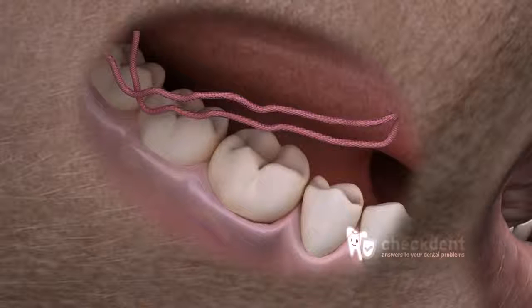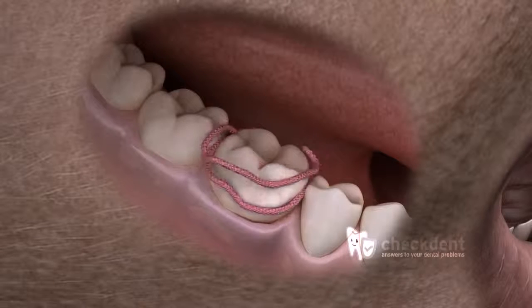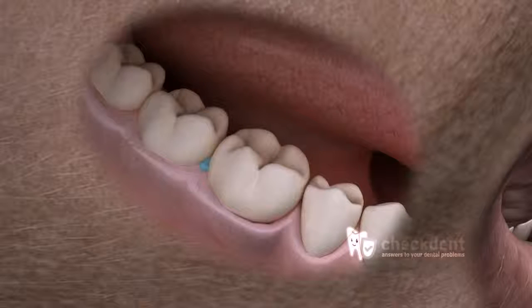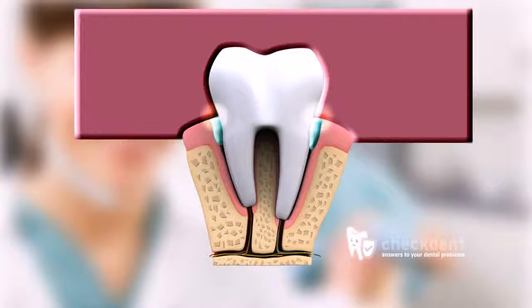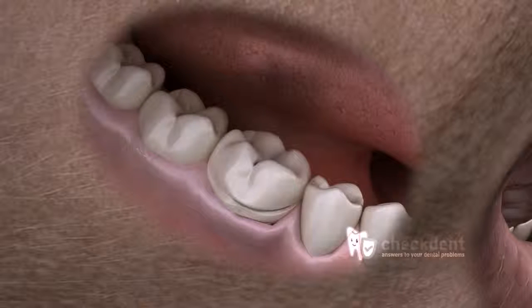Furthermore, particular criteria must be observed while taking the impression. For example, before the impression is taken, 2 gingival retraction cords should be placed, one of which should be removed just before taking the impression. There are various pastes that can replace the gingival retraction cord, but sometimes these chemicals react with the impression medium and can cause distortion. The result will be an ill-fitting crown.